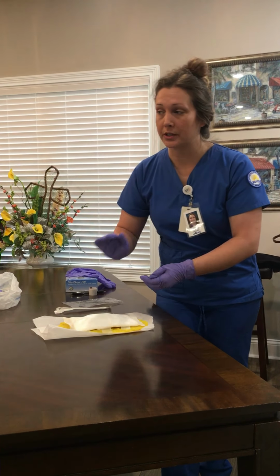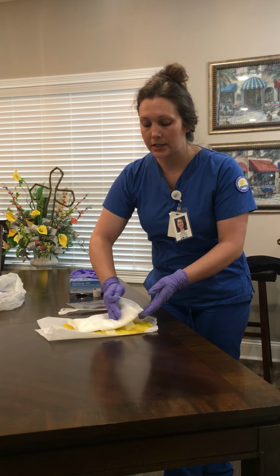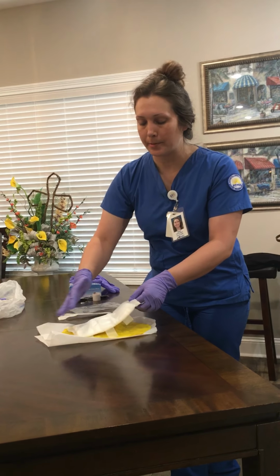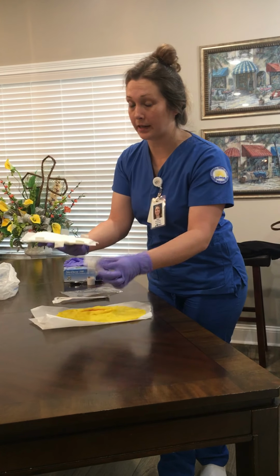Also for the scenario, we're going to pretend that the head of the bed is over here. So you want to remove the dressing in a direction to where the patient can't see it. And the reason for that is they may not like the sight of blood and they may get woozy or whatnot. So you're going to remove the dressing and we're going to remove the packing.